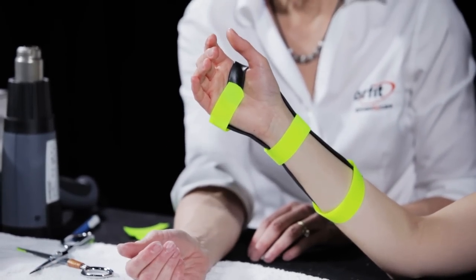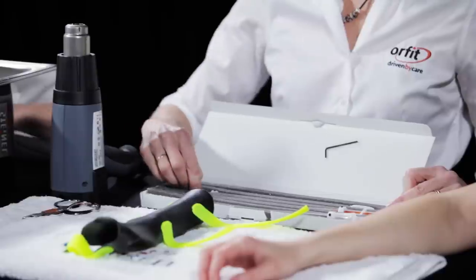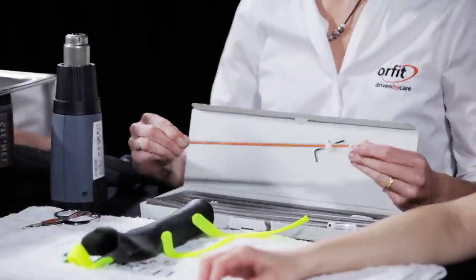Check the fit and comfort of the orthosis on the patient. The orthosis should support the wrist in extension while allowing full finger flexion.